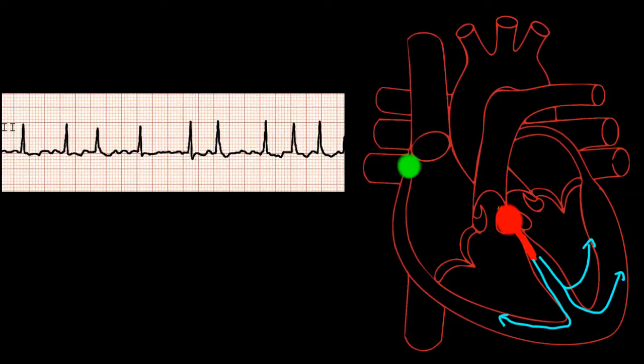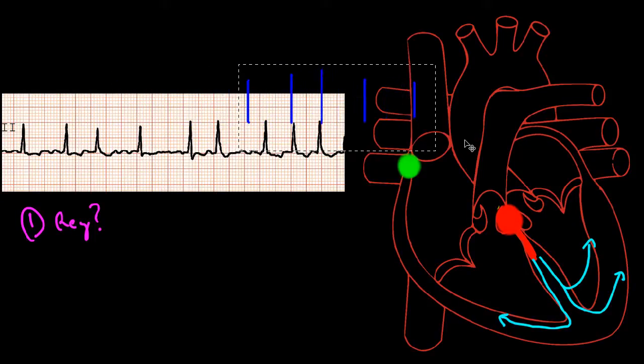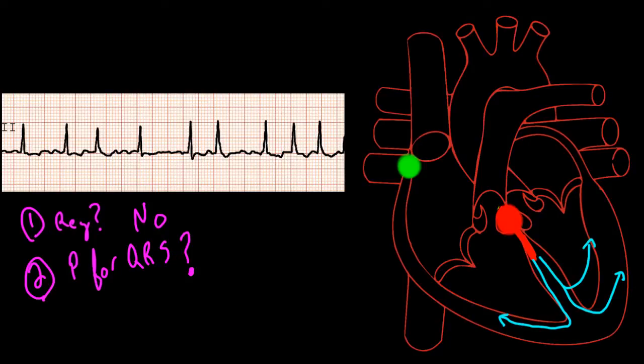Let's look at our third EKG. Again, let's start by asking ourselves the same questions. First, is it regular or irregular? So we can get out our calipers or draw our lines on a sheet of paper again. And if we notice, no matter how we line up the lines, the rhythm doesn't line up perfectly anymore. Second, we'll ask ourselves if there's a P for every QRS and a QRS for every P. Look and try and see any regular P waves. But overall, the atrial activity is completely disorganized. There are some places that look organized, but nothing consistent. So there's no organized P wave activity. This is atrial fibrillation.